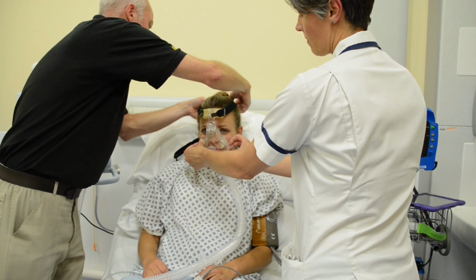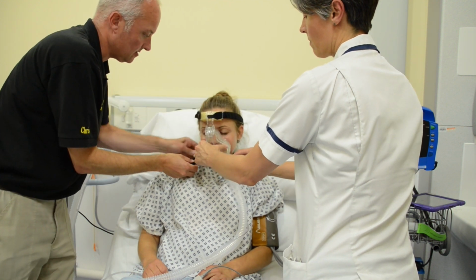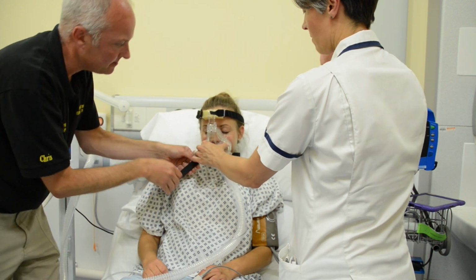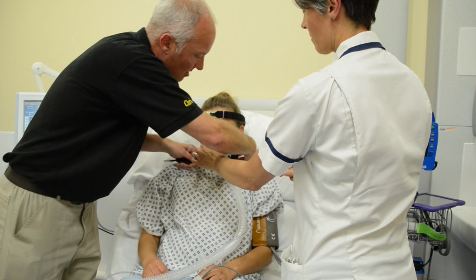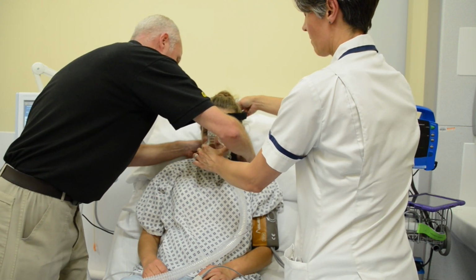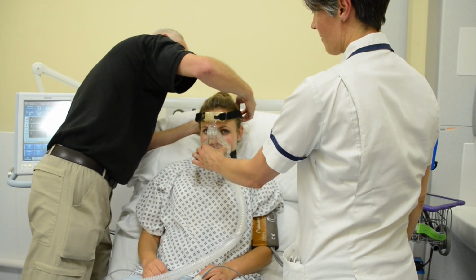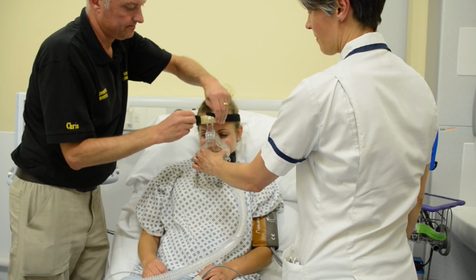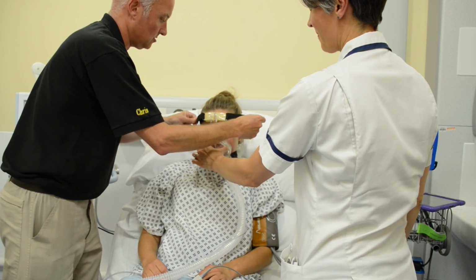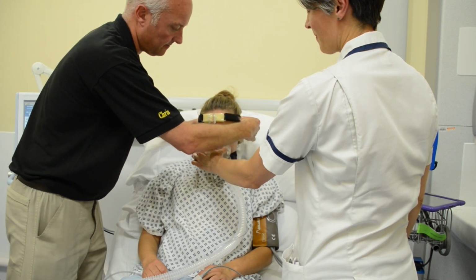Holding the mask onto the patient's face, pull the lower straps down the back of their head and around either side of their neck. This is easier with 2 people to assist. Bring the lower straps to the front of the patient's face and clip into the mask. Tighten the lower straps simultaneously using the Velcro fastenings. Tighten the upper straps in the same way. Then adjust the strap that lies across the top of the head.